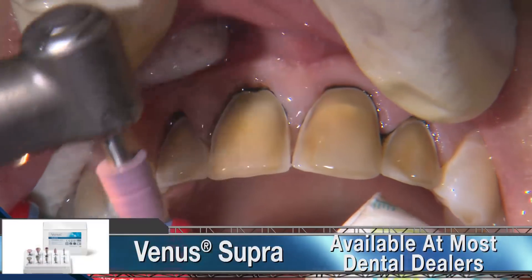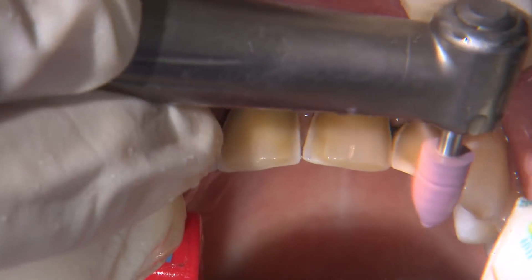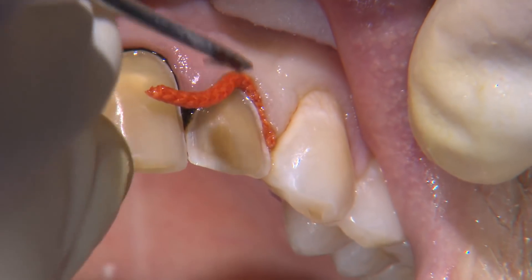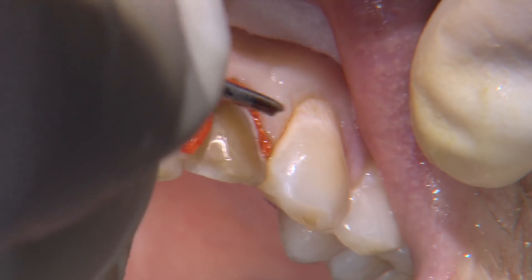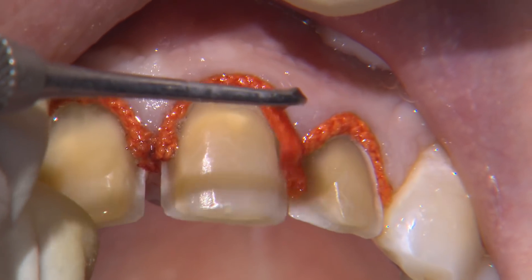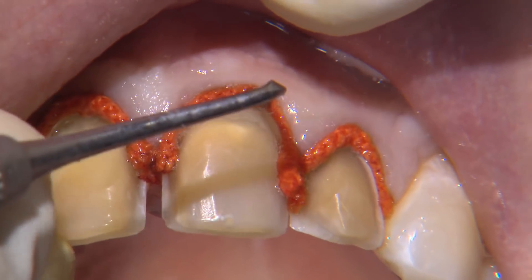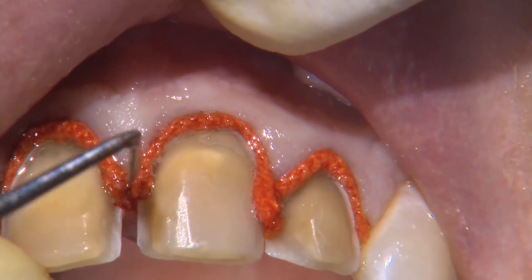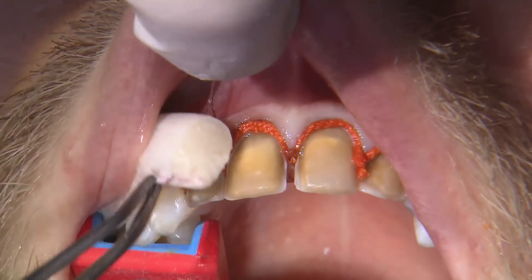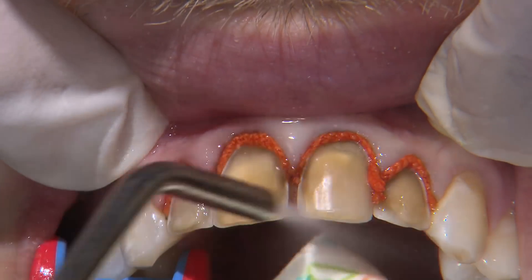I'm using a Venus Supra coarse composite polisher at about 10,000 RPM to round over this transition. To have a smooth path of insertion for the veneers from the facial direction, I angle the incisal parts of the prep cervically from lingual to facial. When the preps are completed, I place a second layer of cord into the sulcus to push the tissue laterally away from the teeth. Here I'm using a size 2 cord, using gentle pressure to push it into the sulcus and then rotating the instrument out to lock it in place. If you're having trouble getting the cord to seat, go down a size until you find one that seats adequately. The cord should be seated without much force, as we want to avoid any potential damage to the attachment.